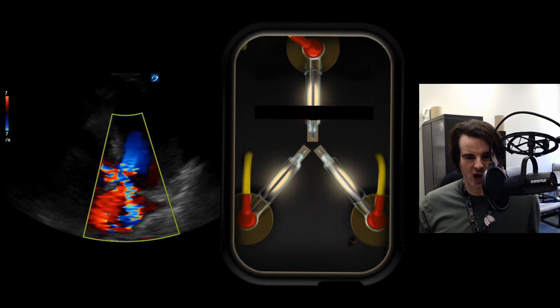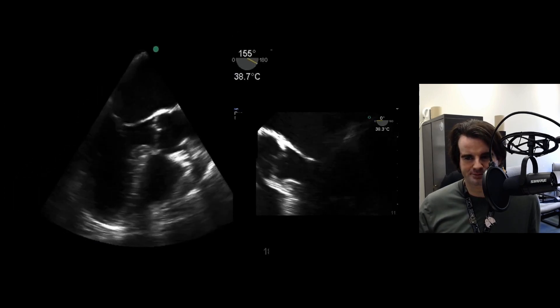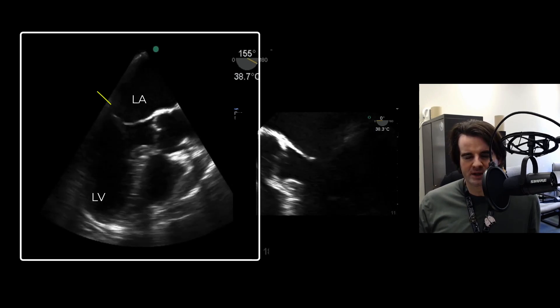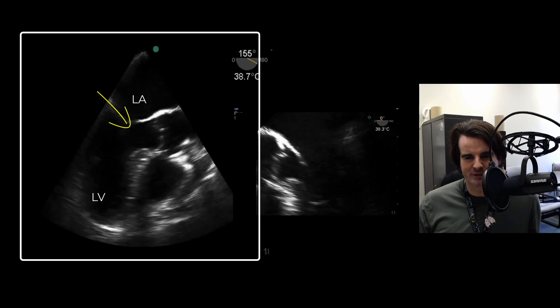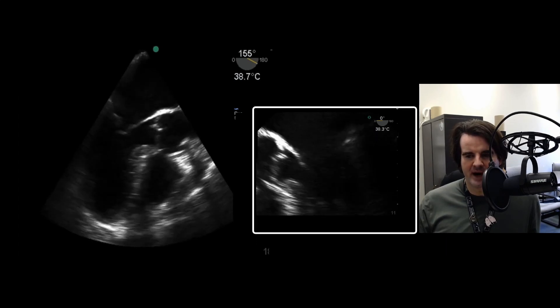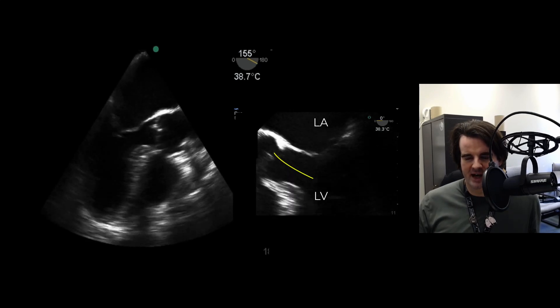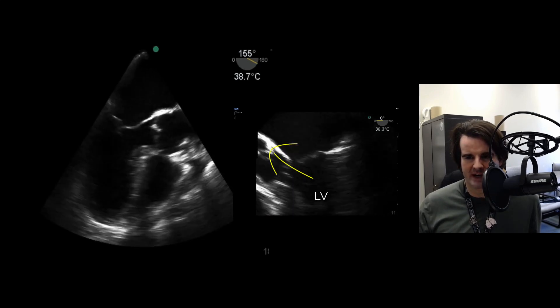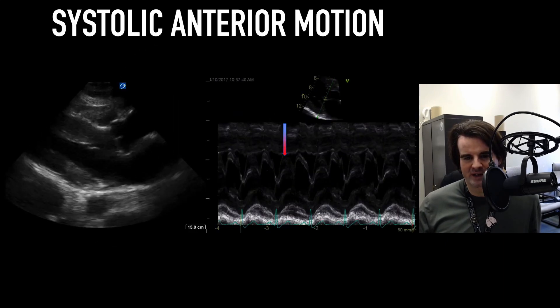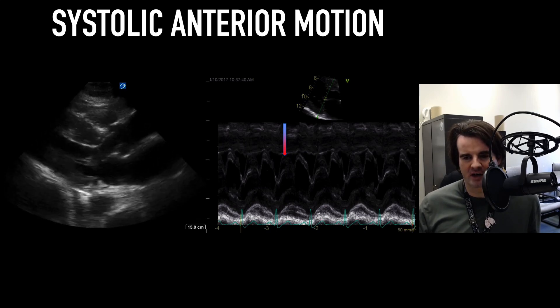This color Doppler signal is what often cues me that there's probably a degree of dynamic obstruction. On the mid-esophageal long axis by transesophageal echo, we can really see that the anterior leaflet is being pulled in during systole, probably causing a degree of obstruction. With the image flipped — showing the left atrium, left ventricle, and outflow tract — you can see that valve being pulled right in. This is systolic anterior motion: the valve moving anteriorly and being pulled into the outflow tract, itself causing obstruction.